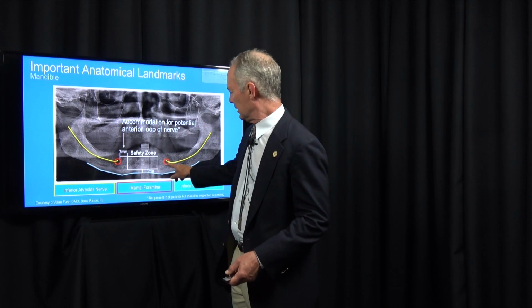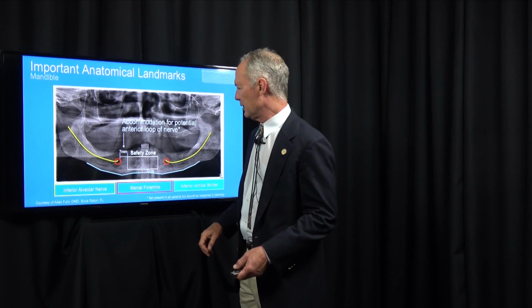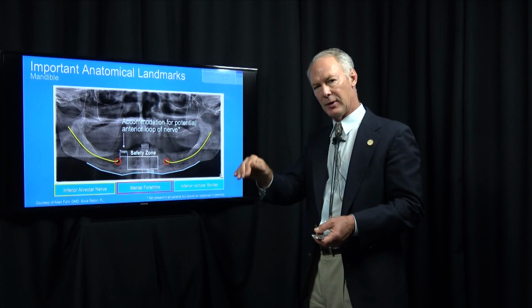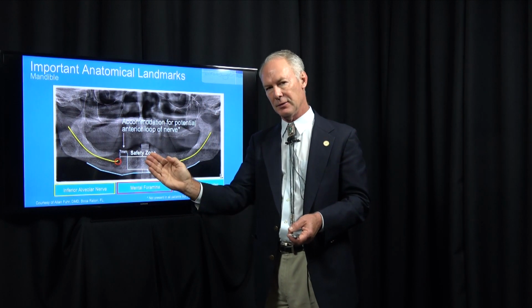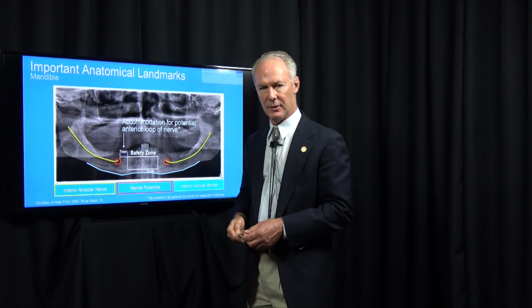So identify the mandibular mental foramen, and you can do that a couple of ways. Sometimes you can just palpate it. Another way is to make a vacuform tray and place some gutta percha cones on the tray with Scotch tape, something like that. Place it on the mandible and take a periapical radiograph. Then you can identify the gutta percha cone in relation to the mental nerve and determine exactly where the mental foramen and the mental nerve are.